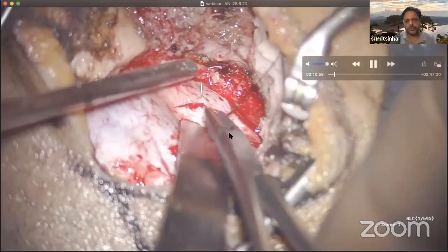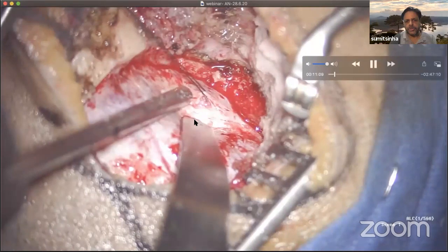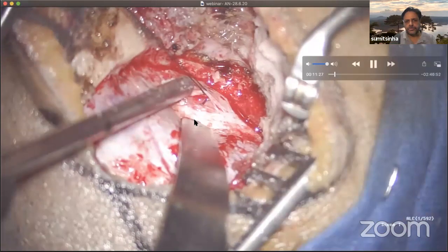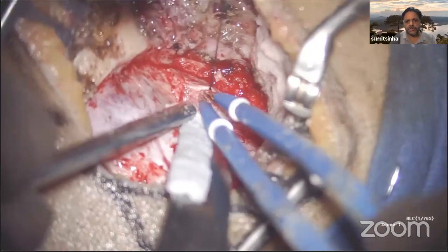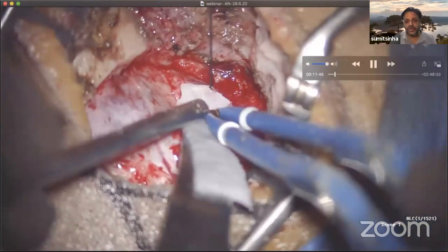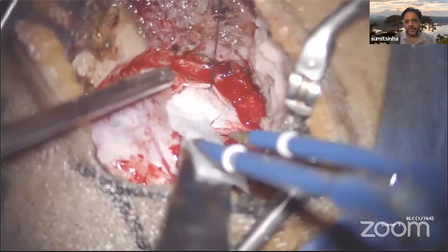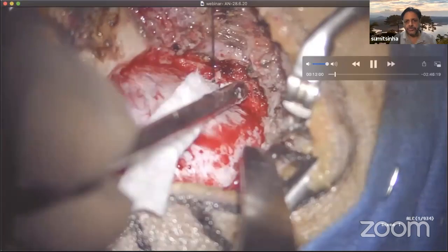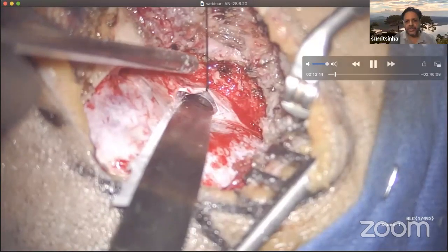You take a stay suture in the V and then make a complete durotomy. Now insert a microcotton patty inside the dura, taking care not to avulse or lacerate the cerebellar tissue. Very gently, you insert your cotton patty inside the dura. Your life is going to become very easy very soon.